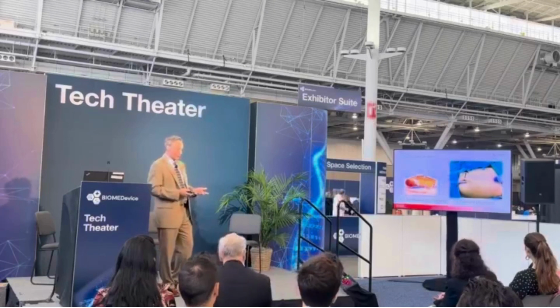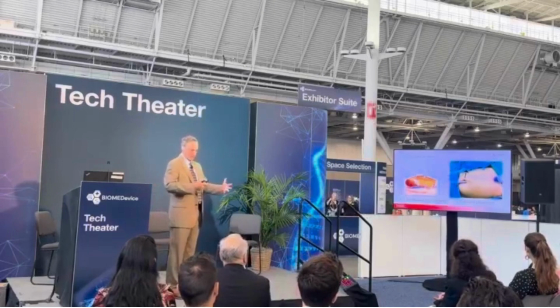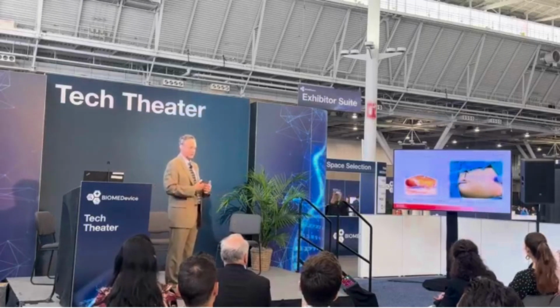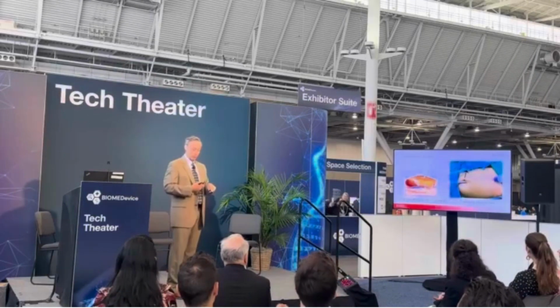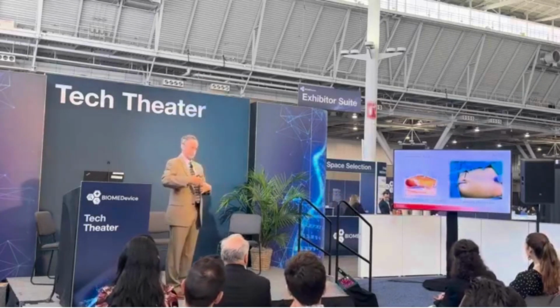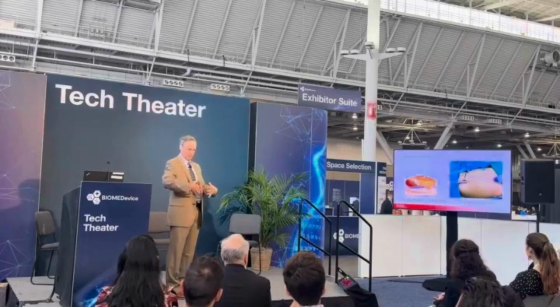In laparoscopic surgery, in the abdomen, to pick an area, it gets blown up with carbon dioxide. And that does a couple of different things. One is it separates the skin from the organs for additional portal placement safely after the first one's inserted. And 2, it provides space. There's a relatively large amount of space to deal with in the abdomen once it's blown up.